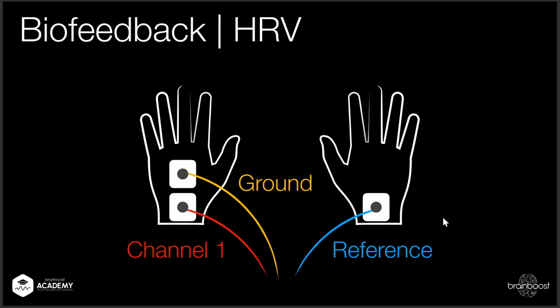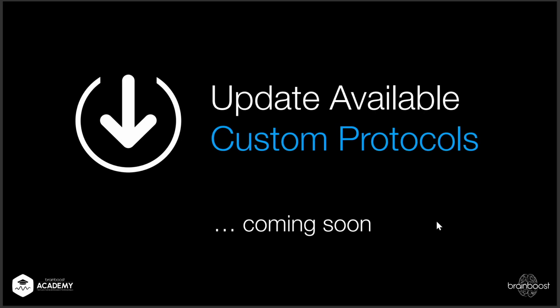Now, I know today was a little bit of a deep dive, but I think the custom frequency bands will be pretty interesting for a lot of people. Now, there's one thing. The update with the custom protocols, with the custom frequency bands is coming soon. I know it's not up there yet, so keep an eye open the next weeks. If there's an update available in the top right of BrainAssistant, then please do the update. Then you will be able to do the custom frequency bands.